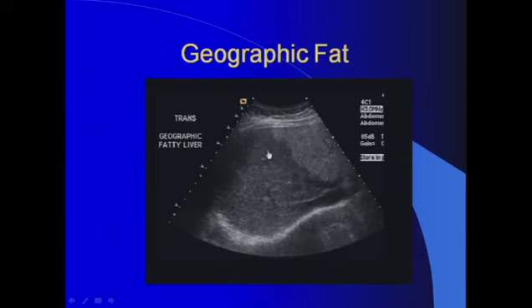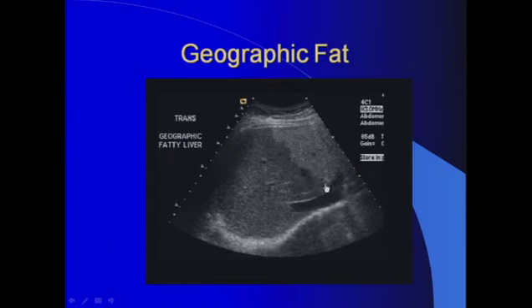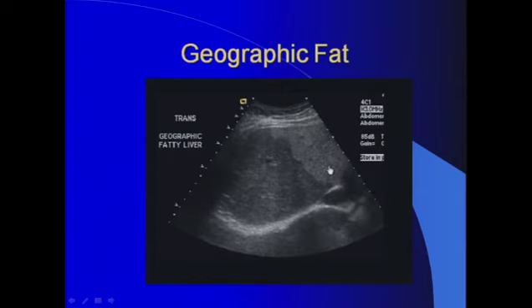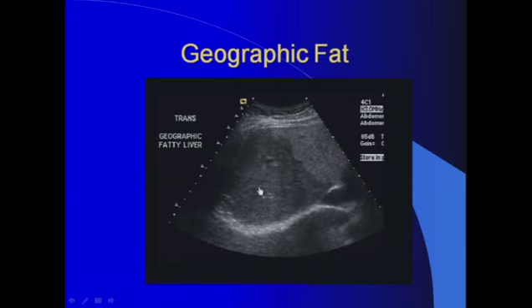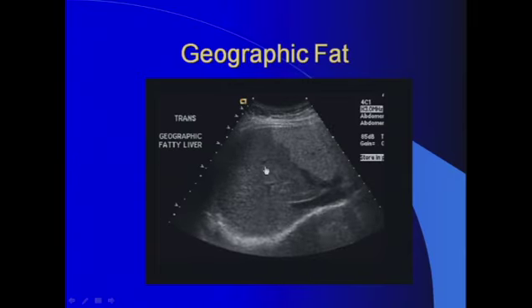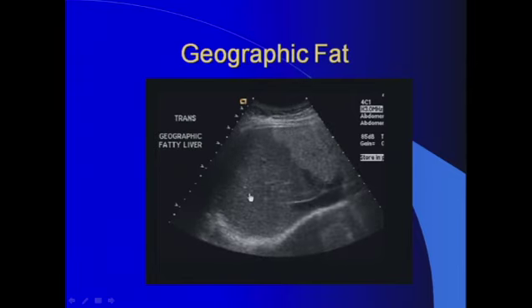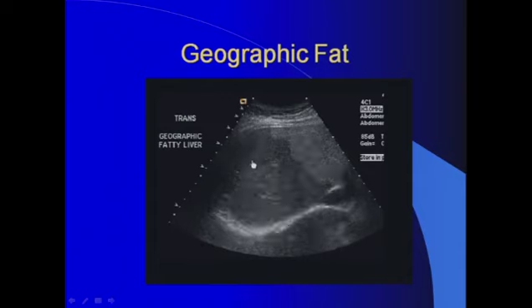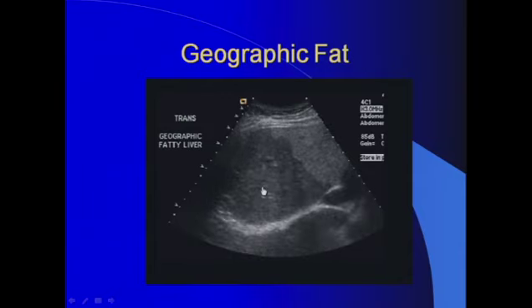You can see that the hepatic vein is coursing nicely through this part of the liver. No evidence of splaying, displacement, or mass effect or invasion. And you can see how nicely the periportal fat and the triads of the biliary system, arteries and bile ducts are depicted on this image on this part of the normal liver.